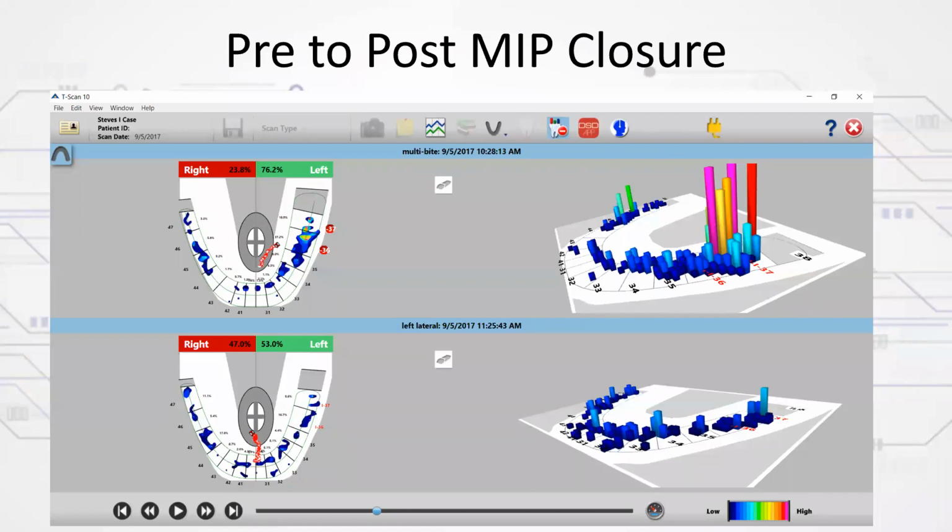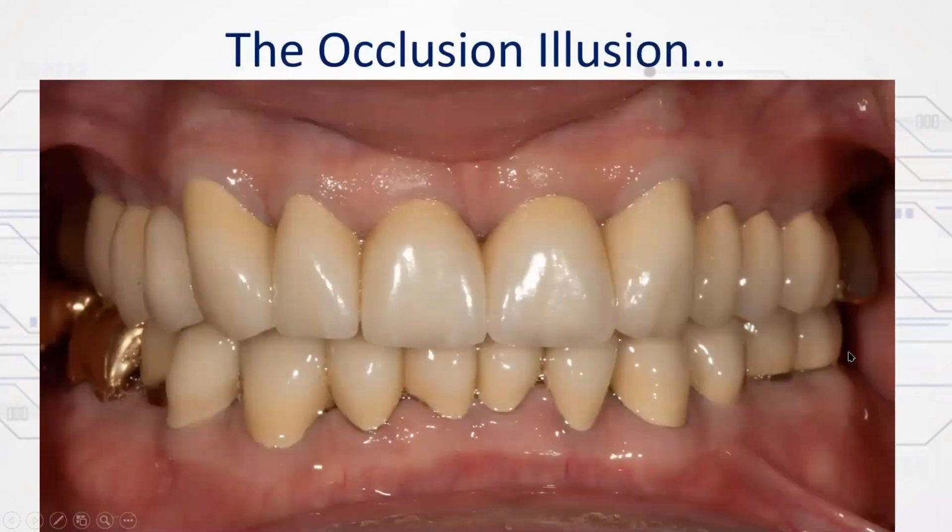This is how the patient could have been sent home, right? That's what I want you to understand. Delivering the case well makes a huge difference in the aftermath, because this is an illusion, right? And this is the problem we face every day. The beautiful dentistry doesn't necessarily work occlusally because we install it with materials that don't really allow us to control the occlusal forces and the occlusal timing.